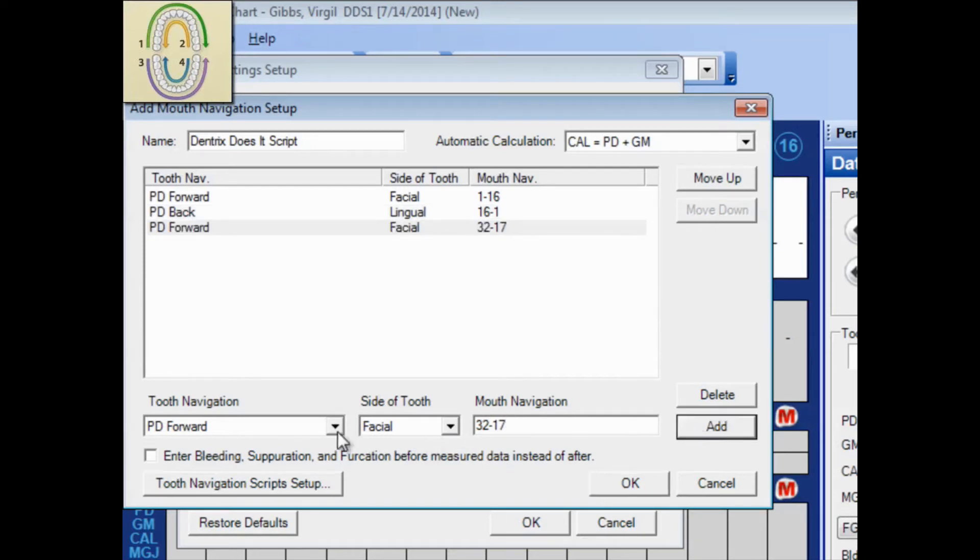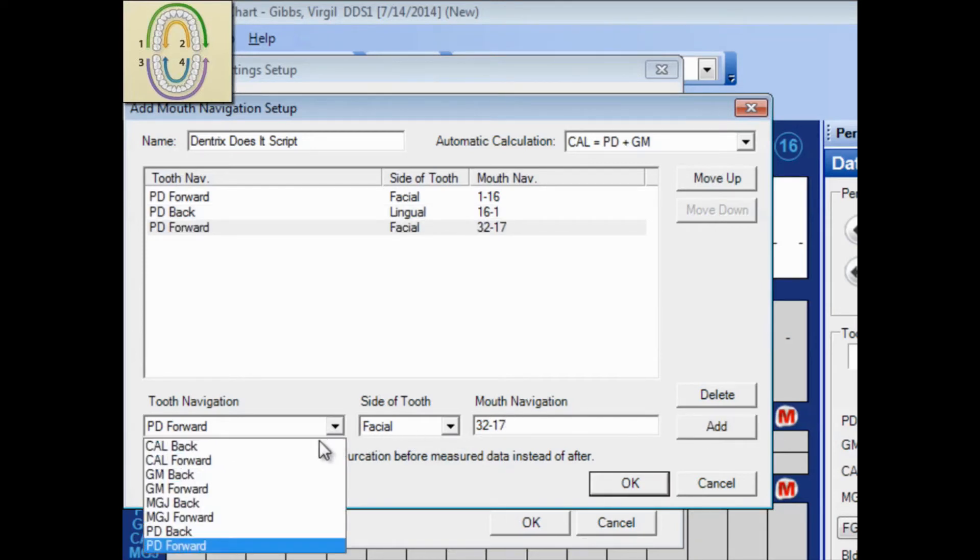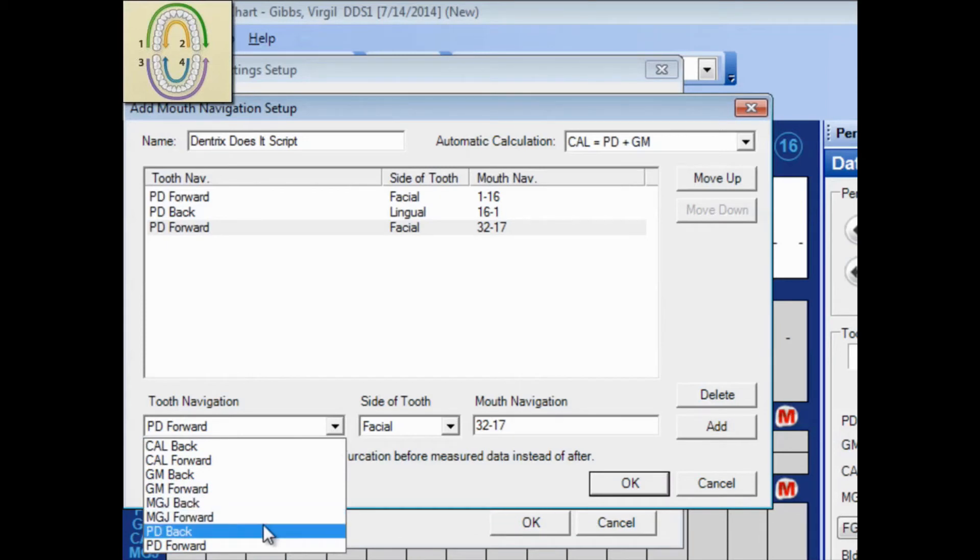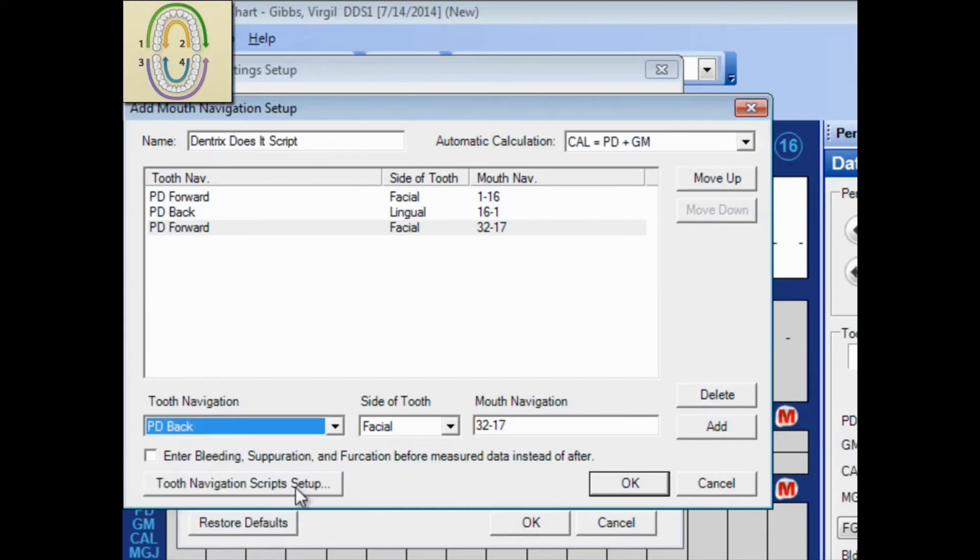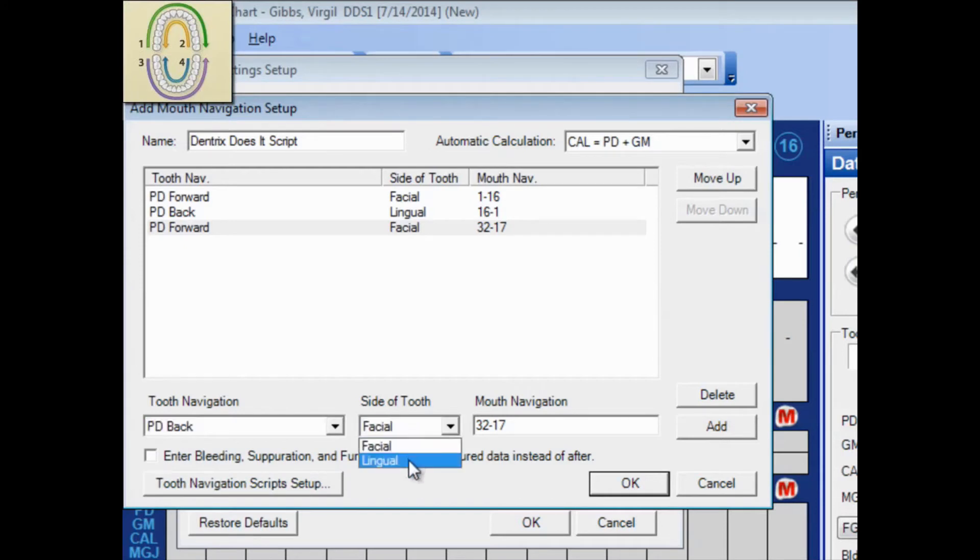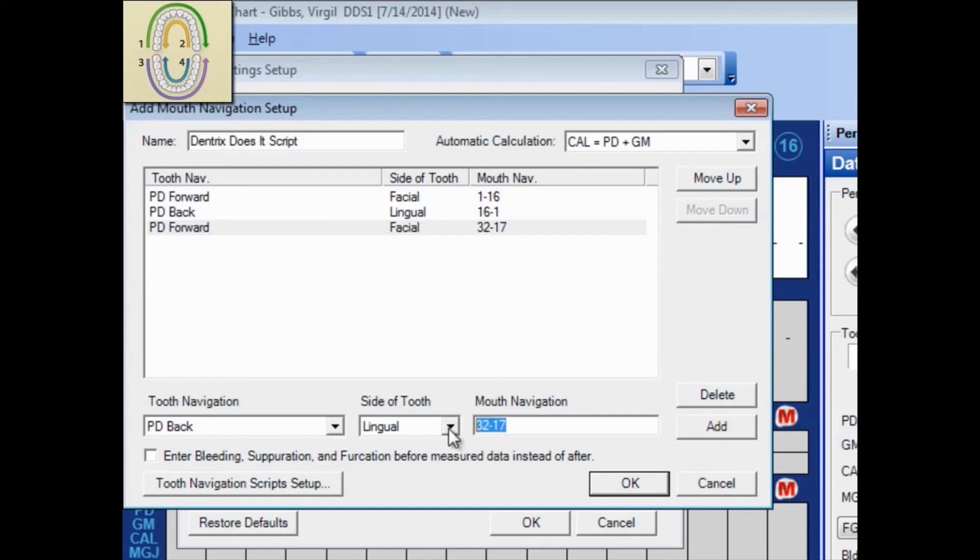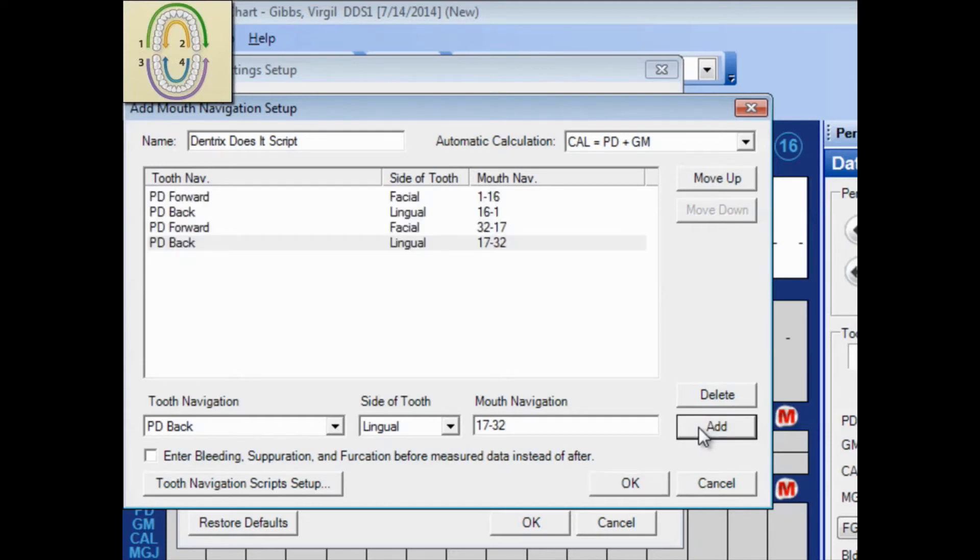And then finally, the fourth line of Part 4 of my script was probing depth, moving backward or right to left, lingual, and 17 through 32. Be sure to click Add on that last line. Some people forget and have to go back in here and add that last line again.